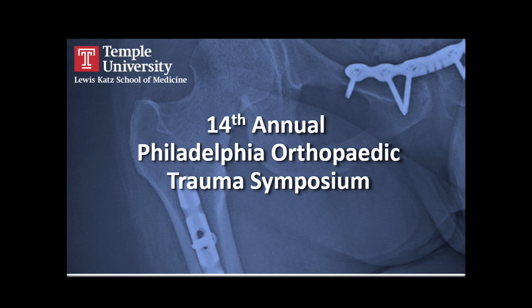I'll just say distal radius fracture with comminution, subchondral and metaphyseal bone loss. You can have your plate go there, it's holding it up well, but the patient needs to make up that bone. Because there's usually bone loss, they have to fill in that whole void. I think if you take that X-fix off, the whole carpus tends to collapse, because the lunate pushes it down. So I usually leave the frame in for at least 2 or 3 months.